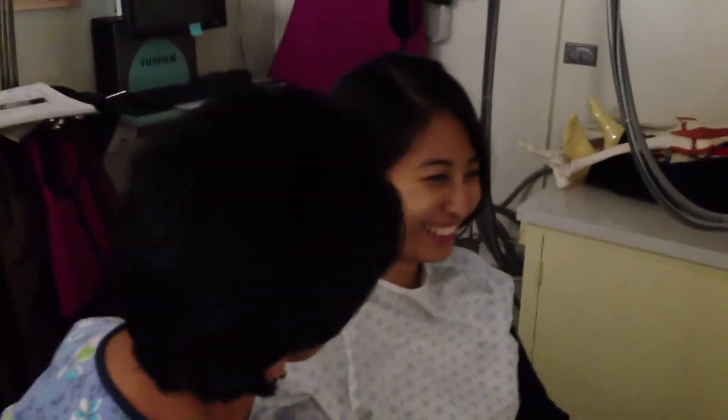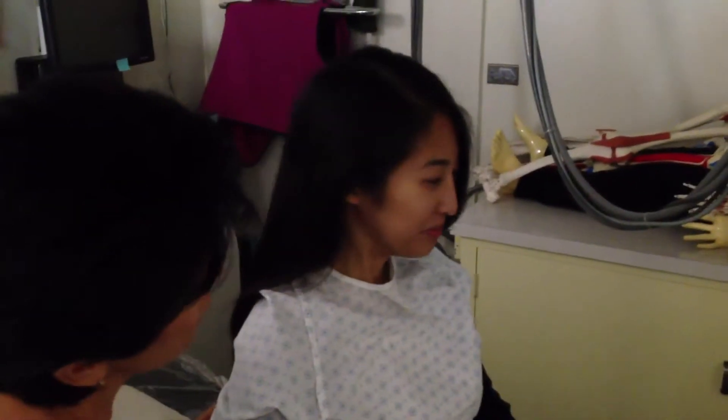How are you doing? A little dizzy. Take some breaths in and out. Keep your eyes open. Take some breaths in and out through your mouth, really deep. Keep your eyes open for me, Catherine. You can't close your eyes.